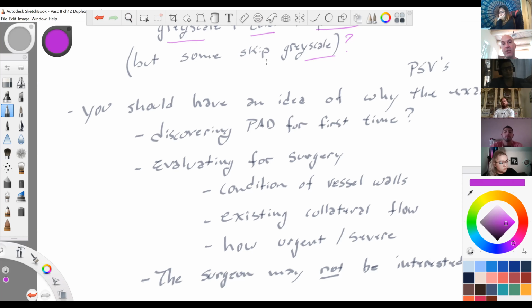If there's a change in spectral patterns between this point and this point, then you got to go back and find out what happened. But if it's triphasic here and triphasic here, I don't think scanning through that really slowly and carefully is worth your time. At least not color and spectral, and it's a lot of work, and some patients are very difficult. So go ahead and jump.